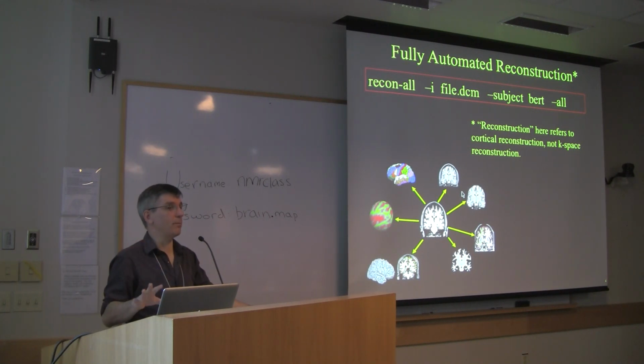What I'm going to talk about for the rest of the talk is what happens when you run this command. Even though it's all fully automated, you might have to get inside of it to fix problems, and also we cannot predict exactly what you're going to need FreeSurfer for. So as part of your education in learning how to use FreeSurfer, we'll tell you a lot of things that are going on inside of the ReconAll command, and the output that it produces, so that you'll be able to get what you need out of it.